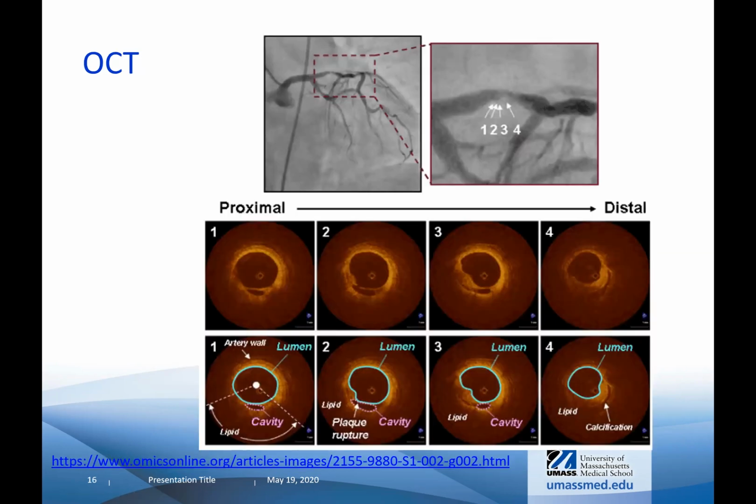When you look at the OCT, it's much prettier, right? You can see much more detail. As you can see, this endothelium, this bright thing, is actually like a sponge. Inside of that is something like elastic fiber, which is actually media, which are muscles. And then right outside of that is the external elastic lamina, which is something to wrap. The external elastic lamina we can see very clearly like a black line.